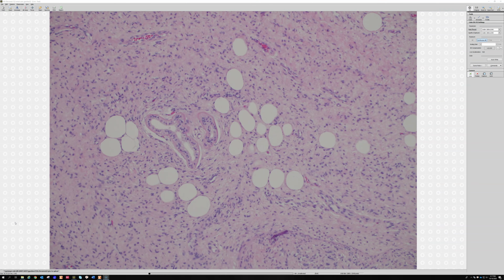So entrapment of fat and also entrapment of the eccrine coils can be seen in diffuse neurofibroma, and particularly when you have NF1 patients with large diffuse neurofibromas, you can actually see it extend down into the muscle and really involve vessels and normal structures deep down, even below the subcutis. So they're benign but can be quite disfiguring.